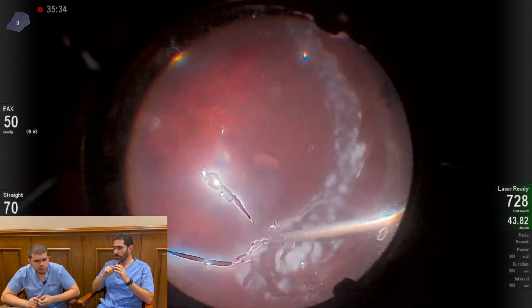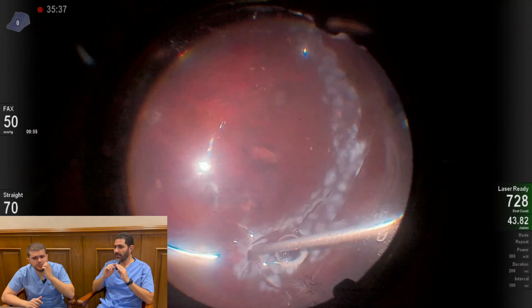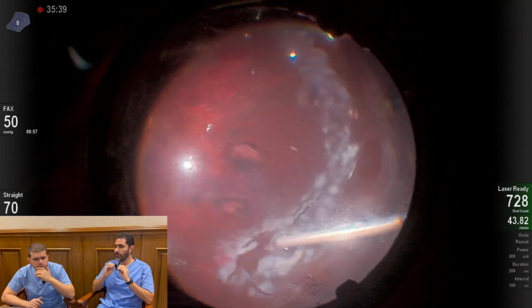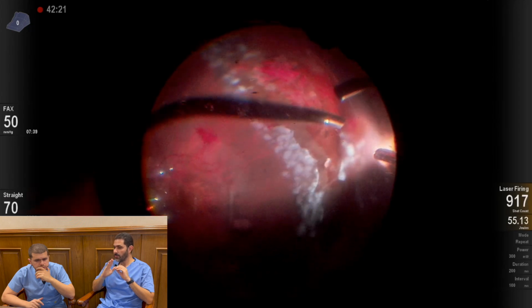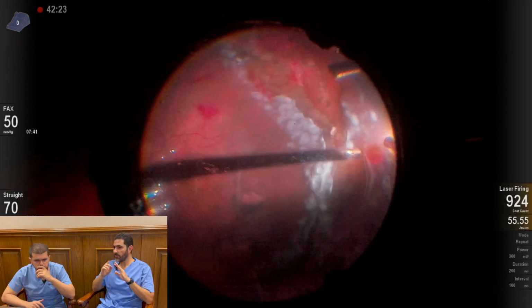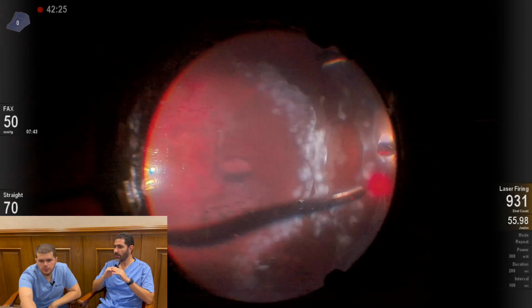But if you are going to do this step, you have to give a very, very good timing for meticulous removal of the fluid, and you keep suctioning the fluid at the edge of the GRT to avoid any slippage later on. Okay. Another question.